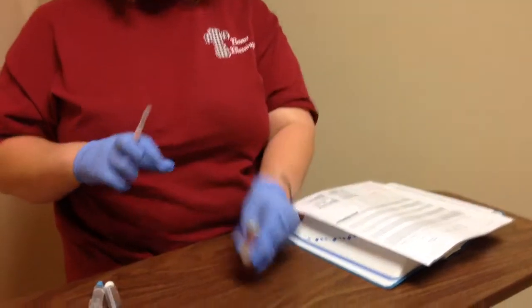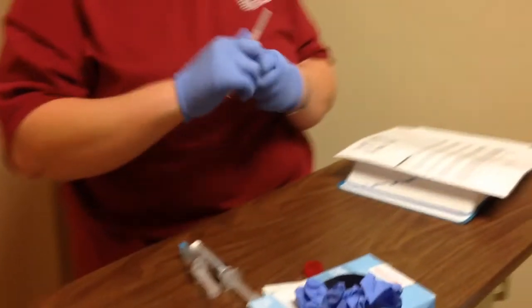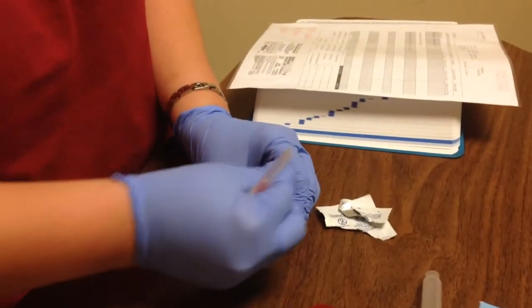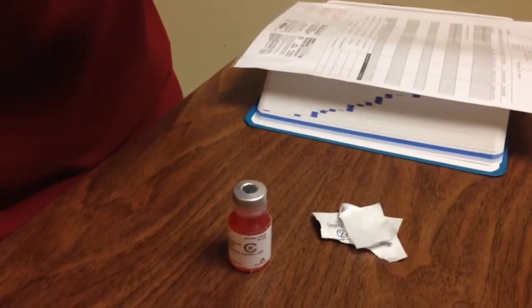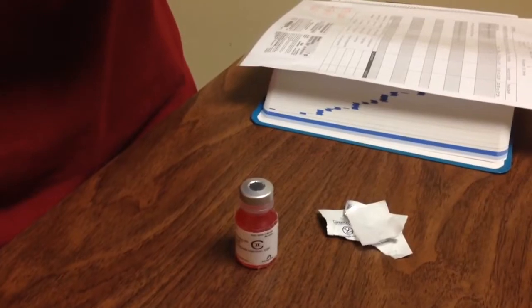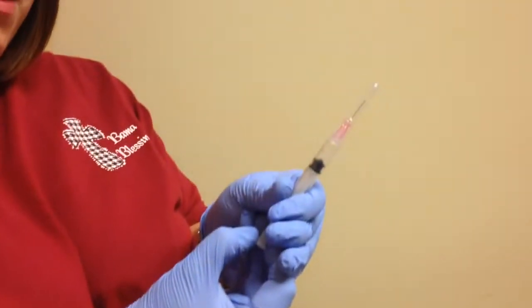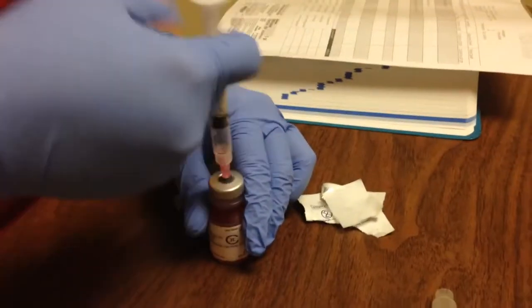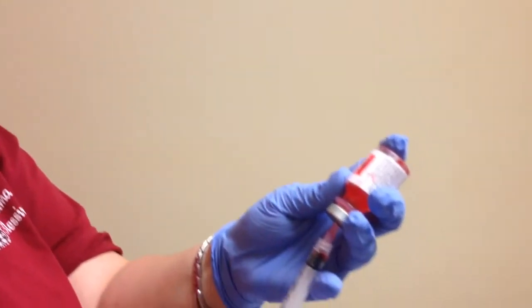Usually these pain meds are going to be a one-time use vial, so more than likely you're just going to pop the top off. But just in case, you can always clean it with the alcohol. Okay. So I'm going to be giving 1 milliliter of medicine, so I'm going to draw up 1 ml of air. Take my cap off. Insert my air. And now I'm going to draw up my medicine.